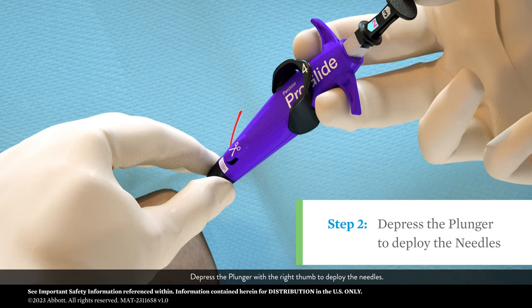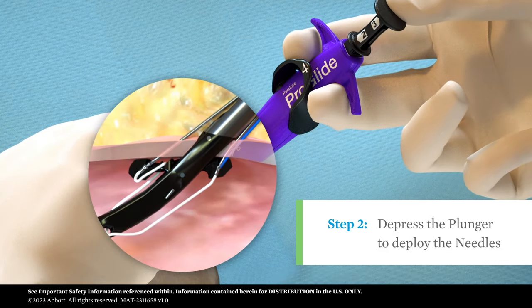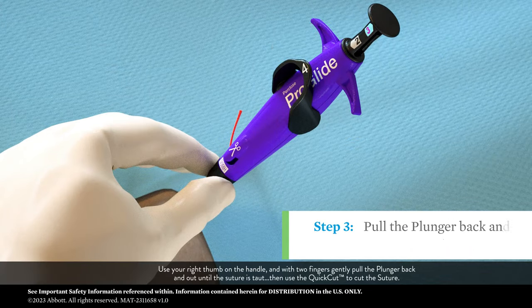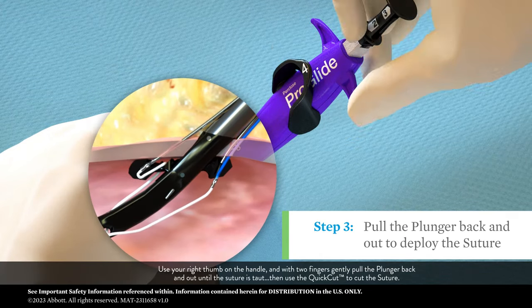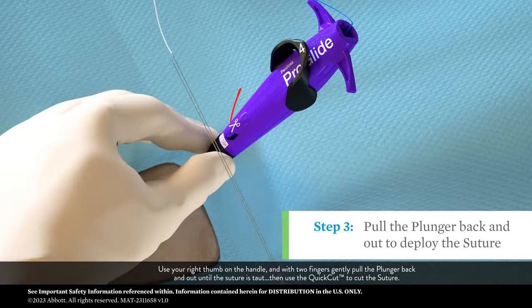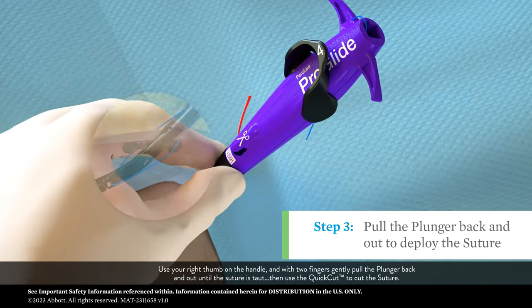Depress the plunger with your right thumb to deploy the needles. Use your right thumb on the handle and with two fingers, gently pull the plunger back and out until the suture is taut. Then use the quick cut to cut the suture.